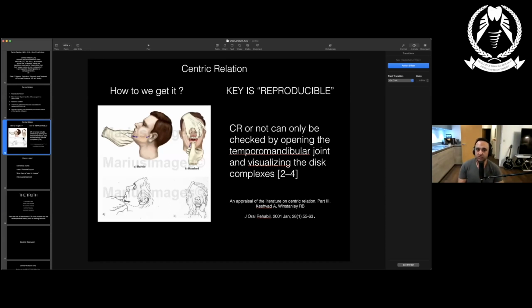that may affect actually going into a more comfortable position. So you could have your patients spending quite a lot of money on a full mouth rehabilitation on implants on one jaw, and suddenly they're just saying, well, I'm getting pain, it doesn't feel right, and you have to go back in, take everything off, and maybe go back to a temporary. So you want to avoid that. Again, my absolute is use temporary restorations, use temporary prostheses to adapt your patients first before going to final, before you're doing all your beautiful ceramic work and porcelain work. Make sure that they are comfortable with where you've restored them. And I think that's a really good and sensible point.